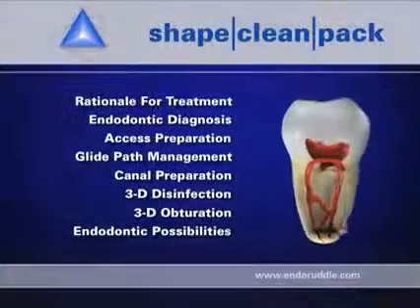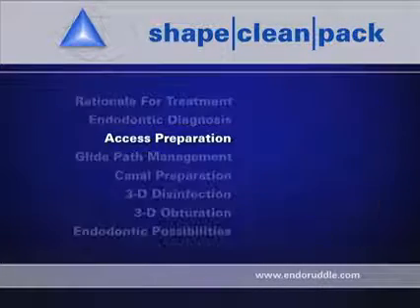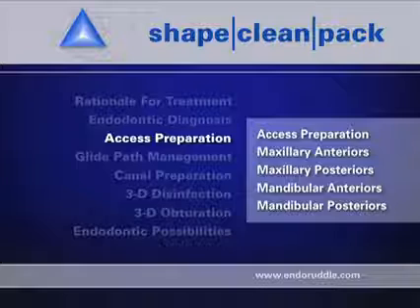In a previous show, we looked at the access preparation in terms of the concepts and tools. Let's look at these concepts and tools in this segment and see how we can utilize them to cut access preparations into the maxillary teeth.